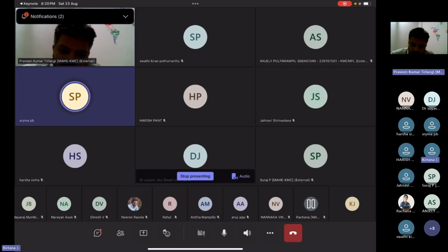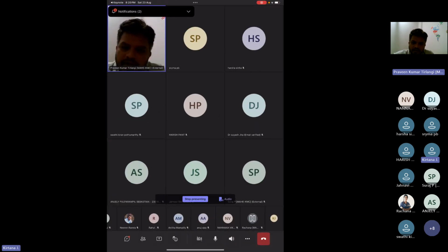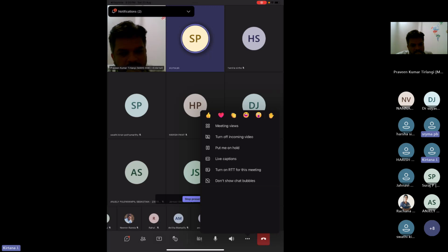So we tried to do it a couple of times, but you have to drop the respiratory rate by like 5 or something, and the patient suddenly becomes a little agitated and starts desaturating in between. Yes. So it has to be done in a passive patient only, a paralyzed patient.